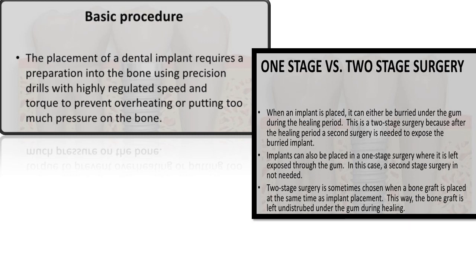They include the inert ceramics and bioactive ceramics. The inert ceramics are alumina, carbon, and zirconia, whereas the bioactive ceramics, as the name suggests, bring about a reaction at the bone and implant surface interface, and they cause bone deposition there. These are the bioactive glasses, glass ceramics, and the calcium phosphates.